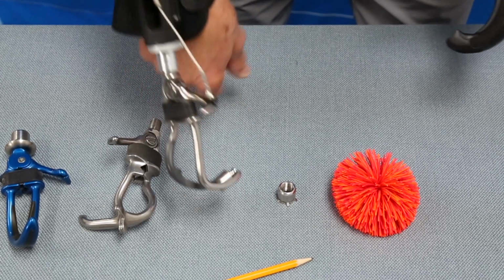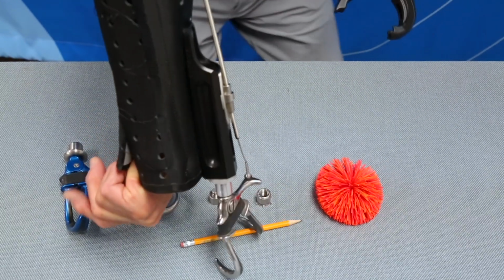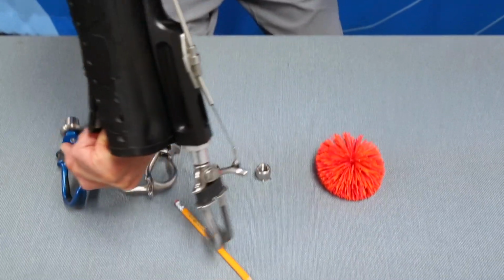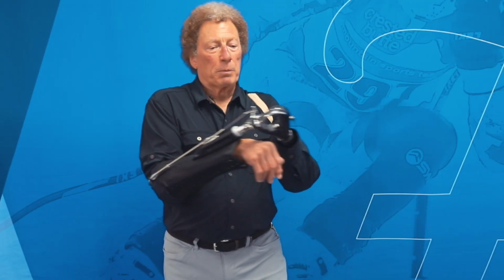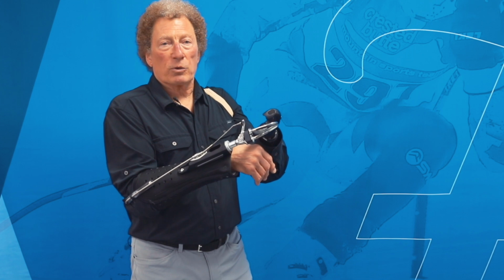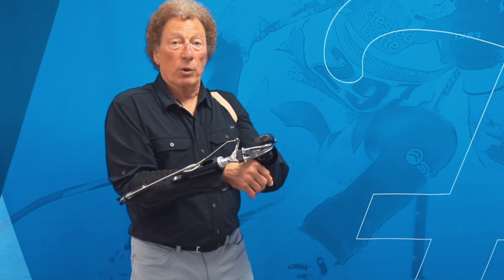They all operate with a voluntary opening control. They have a narrow grasping surface, so they're very good for picking up a small diameter object. You can pick up fine things with them without a great deal of problem. That's where their enhanced value is. They get their strength and power from elastic bands or springs that are mounted around here. So every time you open them, you're overcoming whatever load that is.